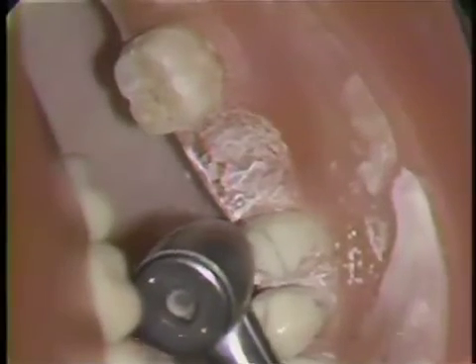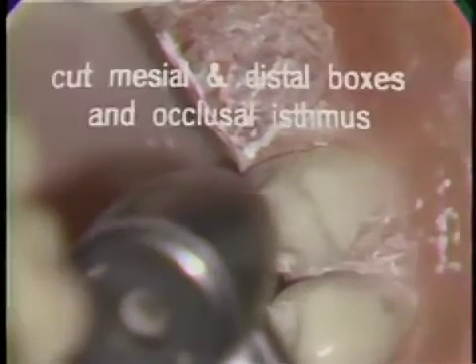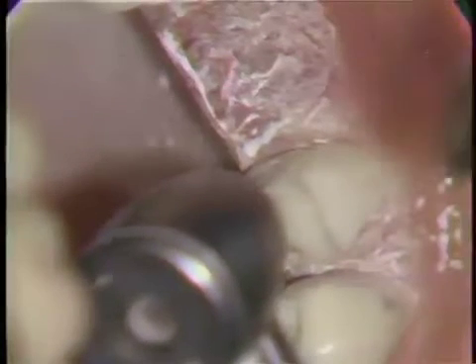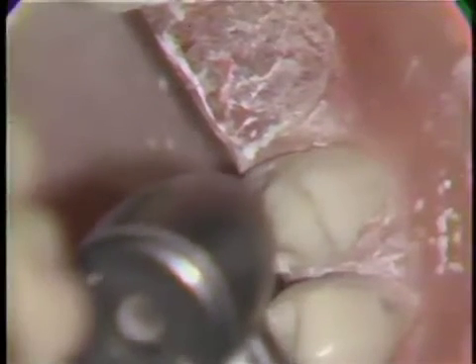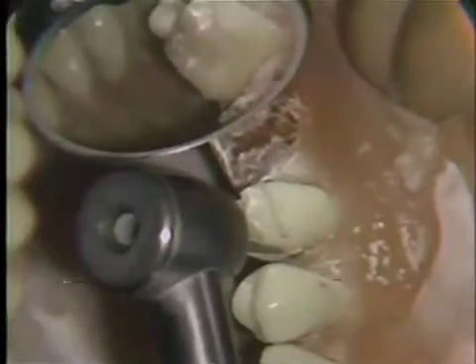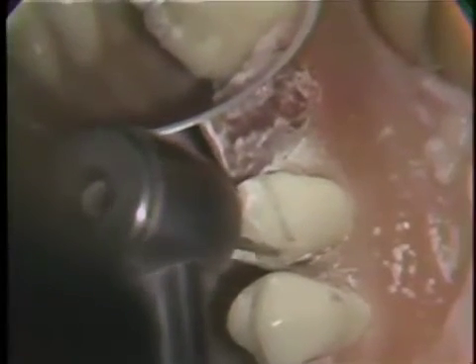The next step is to place the distal box on the bicuspid, using the mesial box on the molar as a guide for parallelism. The distal box is prepared with a 170 carbide burr. The mesial box is placed parallel to the distal box of the bicuspid and the mesial box of the molar, taking care not to extend it too far to the buccal surface. You'll note that the carbide burr is pendulated in order to give adequate width to the box.